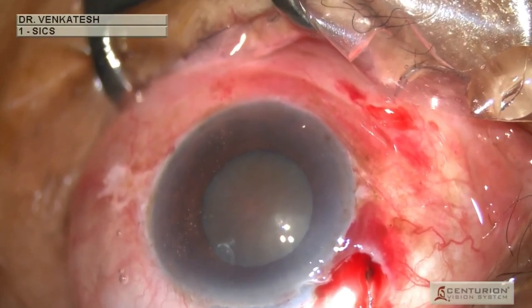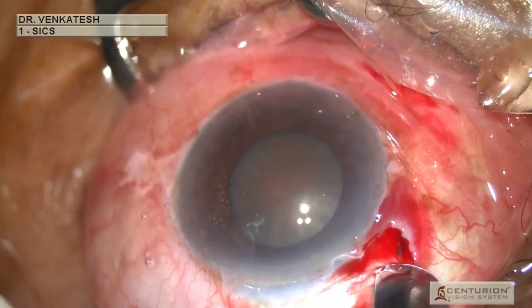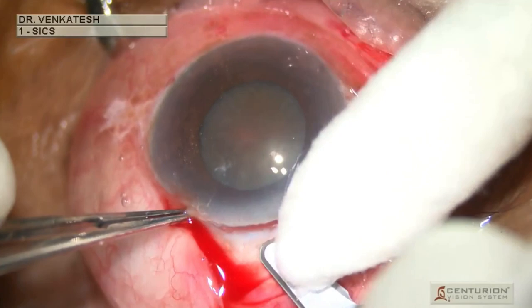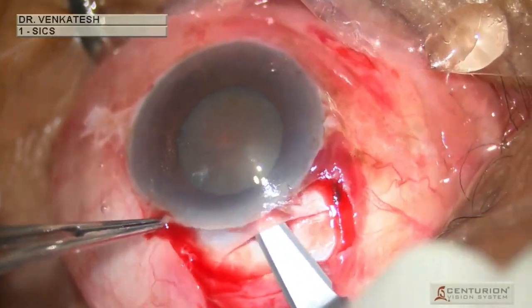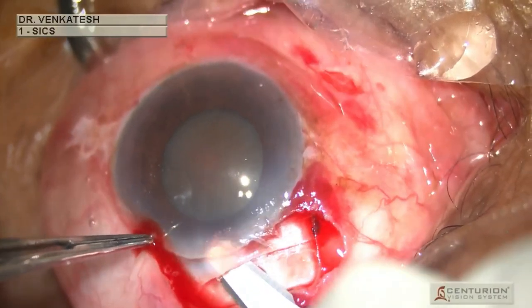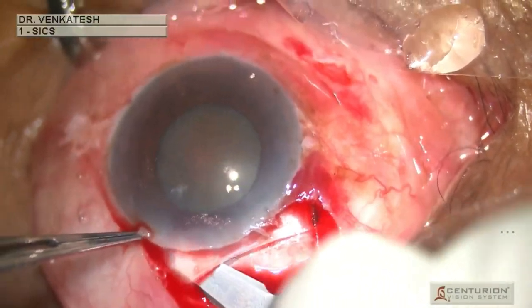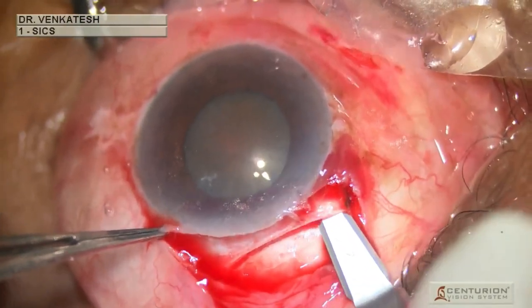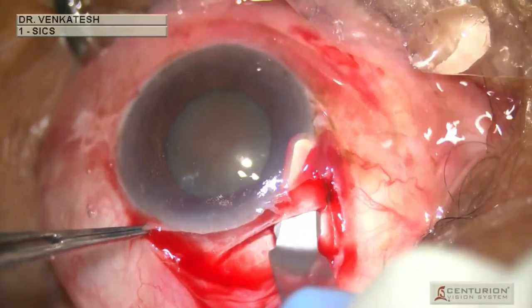Using a number 15 surgical blade, a moderate frown-shaped incision of around eight millimeters is made. The crescent blade is then used to swipe along the tunnel until the right plane is achieved, and then with wriggling movements the corneal part of the tunnel is constructed. Swiping movements are performed on both sides and the sclerocorneal tunnel is completed.